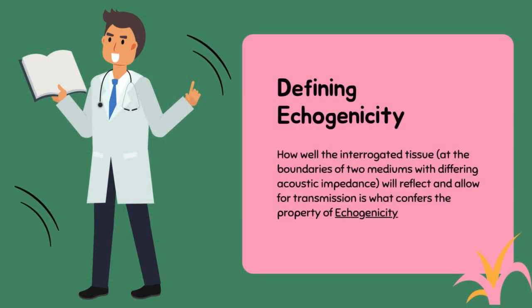To summarize, how well the interrogated tissue will reflect or allow for transmission of sound waves is what confers the property of echogenicity.